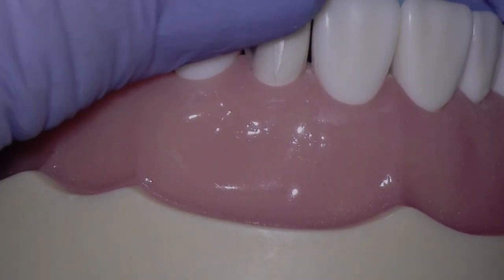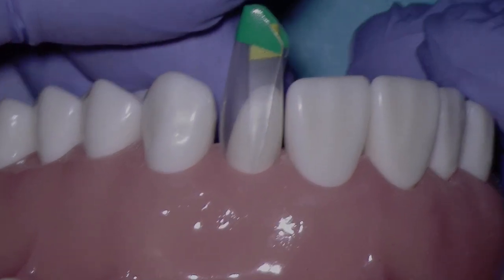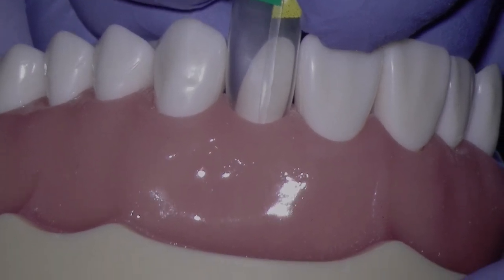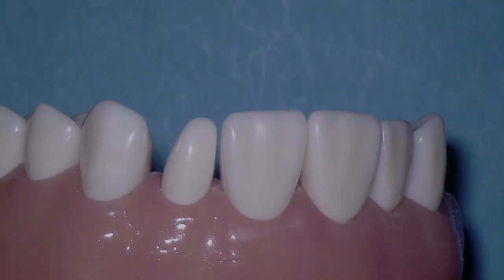I'll be looking at the matrix on the distal now. That's going to give us a nice shape once we're able to create the direct contact strut. So let's go ahead and go through the process. The first thing that we would do is to disclose and blast the tooth to remove biofilm and the protein pellicle. So let's go ahead and do that now.